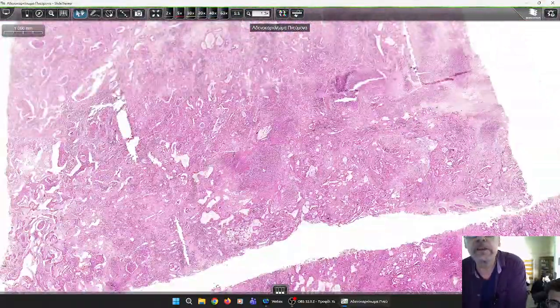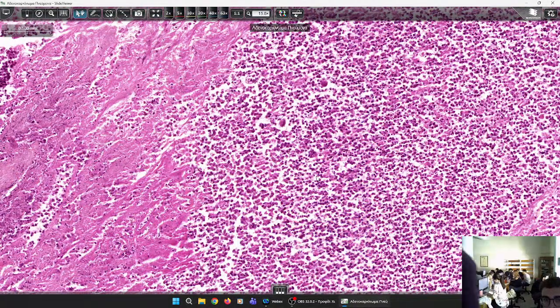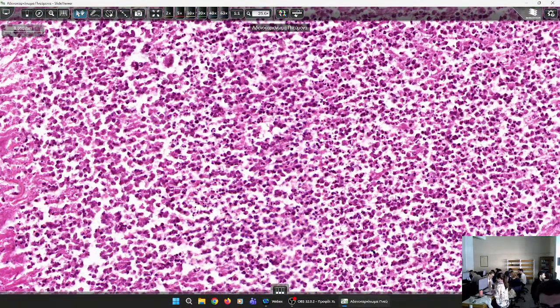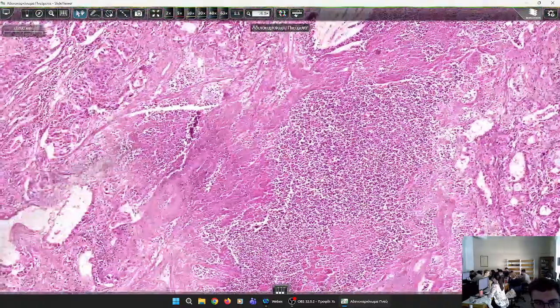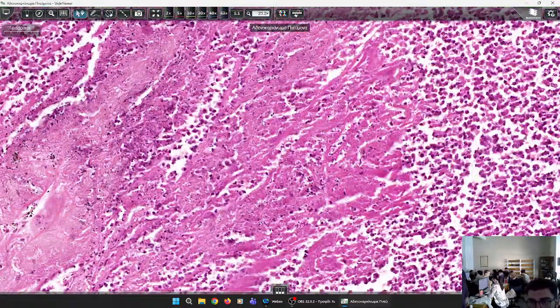All right? And what else can we see? This area. Please identify what happened here to the cancerous tissue. We have all this acute inflammatory exudate there, and adjacent to this accumulation of acute inflammatory cells, you have this tissue. What is this area within the parenchyma of the tumor?